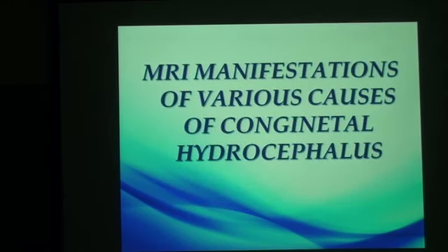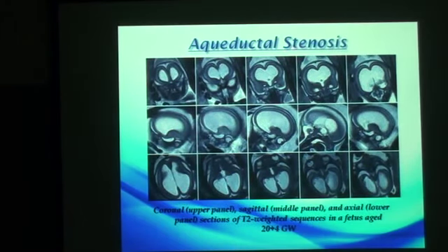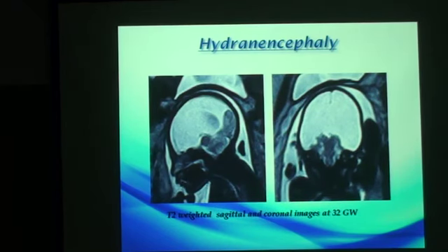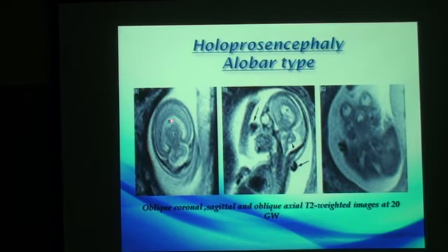Let us discuss some of the MRI manifestations of various causes of congenital hydrocephalus. Aqueductal stenosis is the most common type of simple congenital hydrocephalus. We can see supratentorial dilatation of the lateral ventricles and the third ventricle, yet the fourth ventricle is normal in size. In hydranencephaly, the brain is completely replaced by CSF with only remnants of the thalami and occipital lobe. We can identify it by the presence of an intact falx, to differentiate it from the alobar type of holoprosencephaly, in which there is absent interhemispheric fissure, falx, corpus callosum, and septum pellucidum.